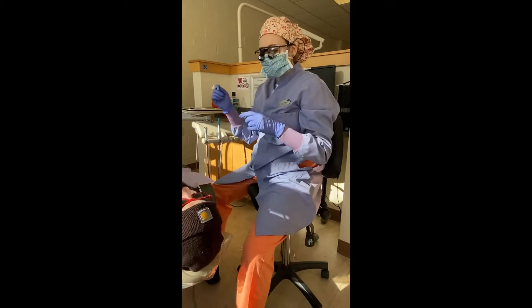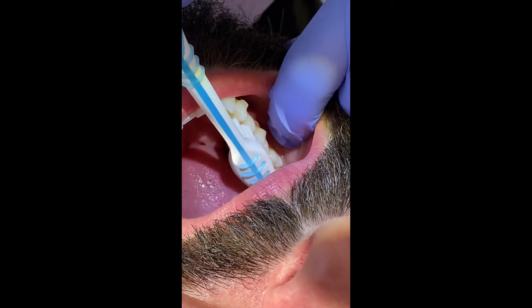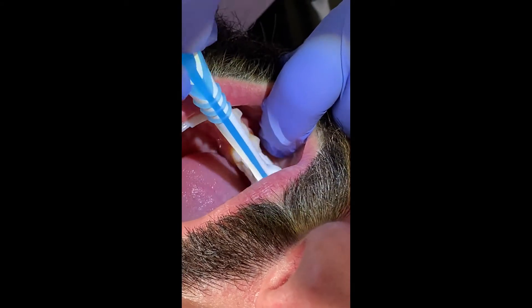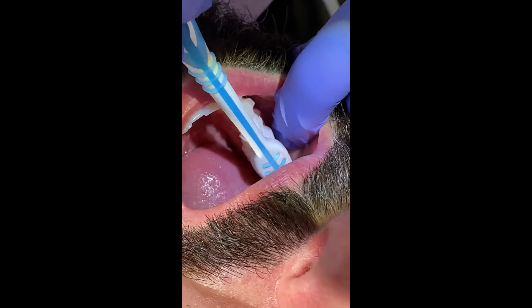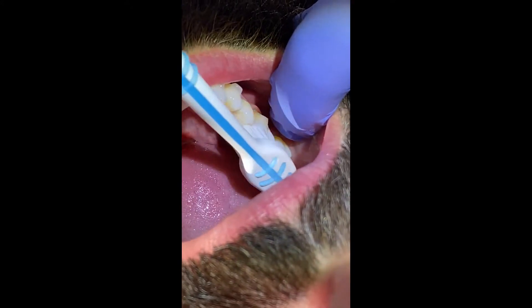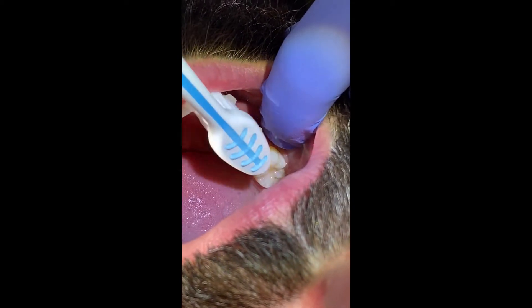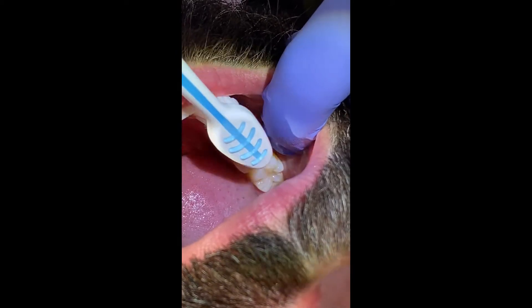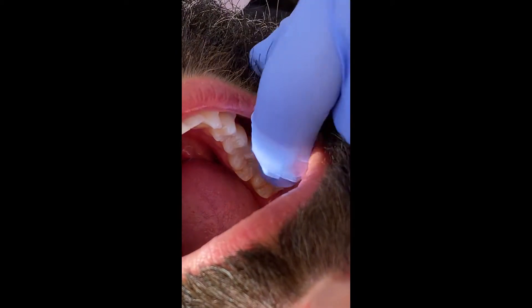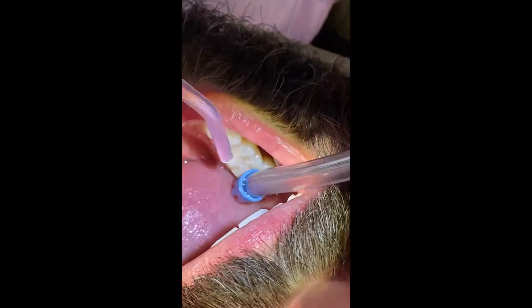Go ahead and open for me. We're going to brush the patient's occlusal surfaces of the teeth with medium to firm pressure to really make sure that we don't leave any remaining substance in those pits and grooves. Once we feel like we've gotten everything, we're going to go ahead one more time with our water and suction and rinse the surfaces off.